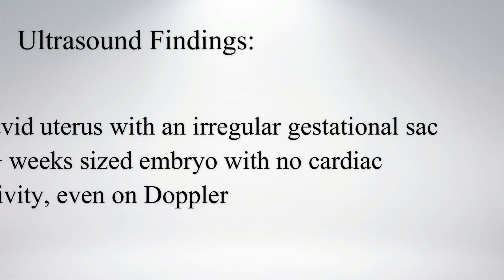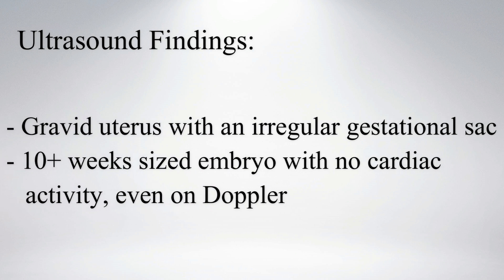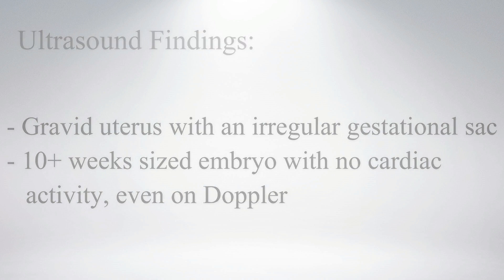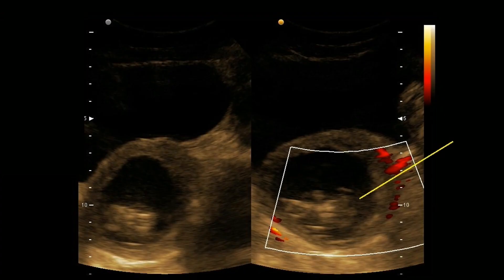On ultrasound, an irregular gestational sac is noted within a gravid uterus. A 10-plus week-sized embryo is seen within the sac with no cardiac activity, even on Doppler. The gestational sac outline is slightly irregular on these images.